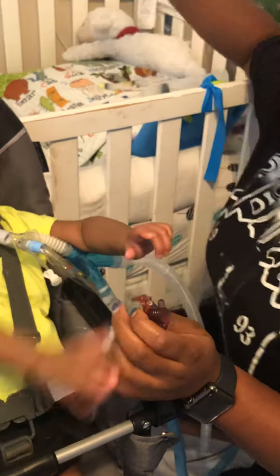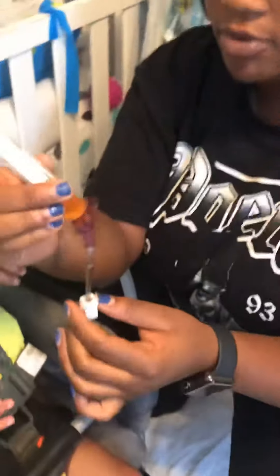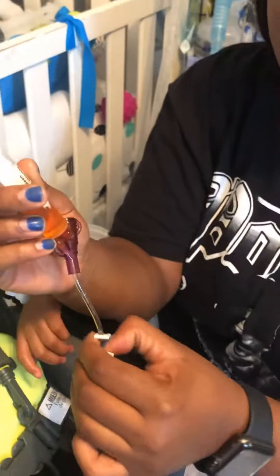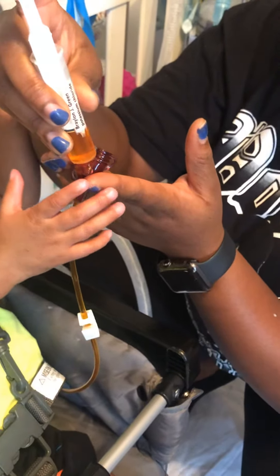You're going to take the syringe of the medicine and put it in the small port. Then you're going to open this little clasp and slowly put the medicine in.